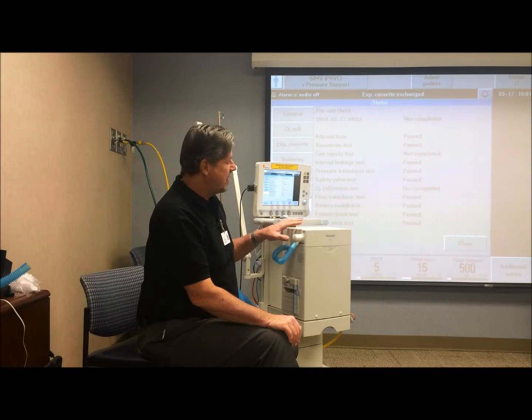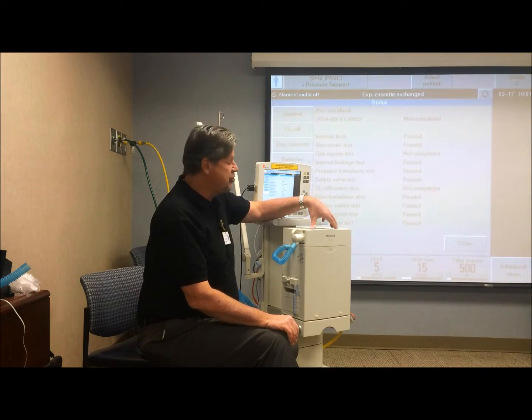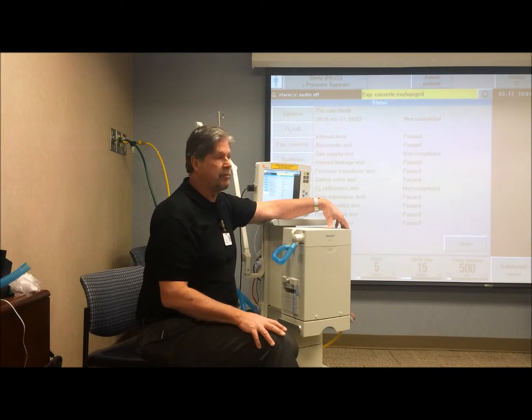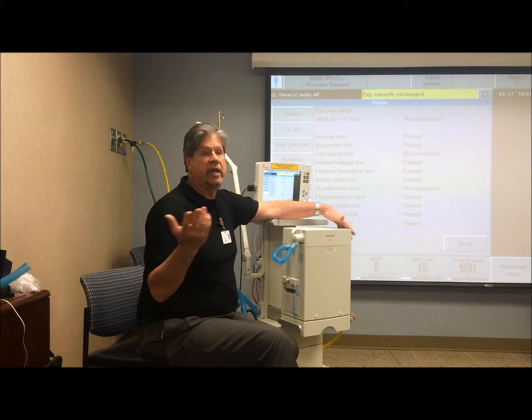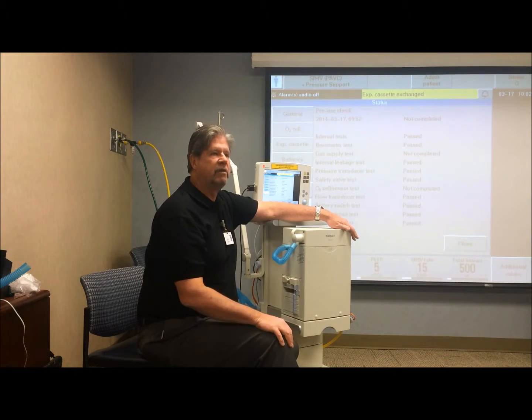Okay? So in the event that there is a leak in the cassette, it's usually from a couple of different sources, just a couple limited sources. And what could they be? What have you guys found in your troubleshooting, in terms of cassettes? I don't do a lot of troubleshooting cassettes. The only thing I do is the O-ring. Fluid.